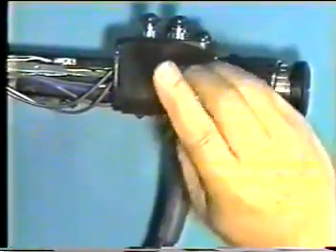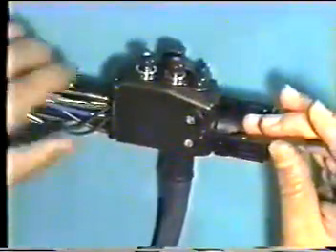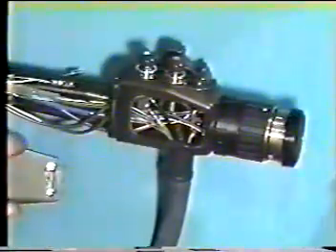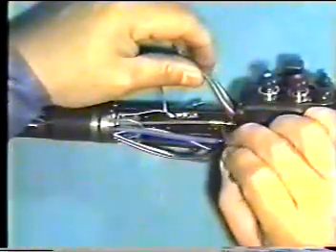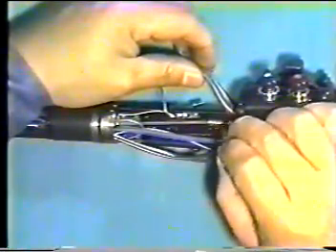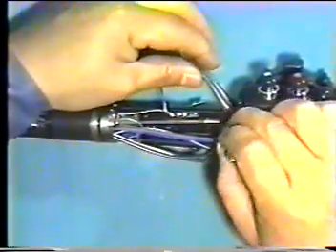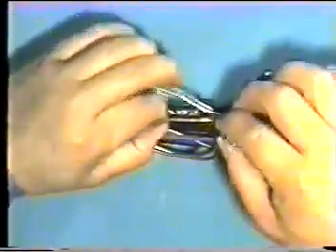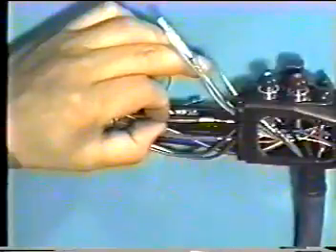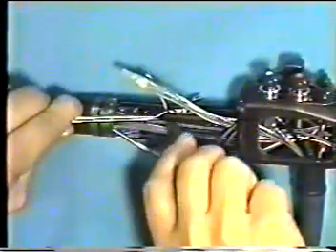Remove 2 screws. Insert a screwdriver into groove of the side cover and pop it up. Apply the same procedure as FCT on removing AWT, that is air-water tubes. Desolder the grounding wire from the base.